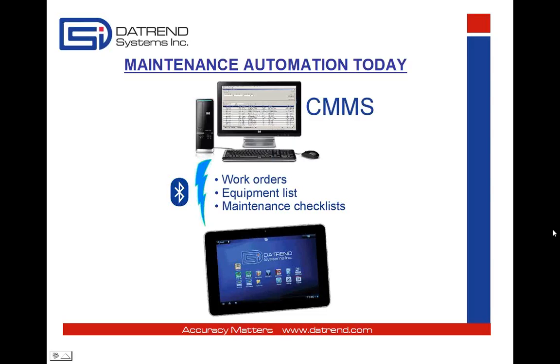Your CMMS is running on a workstation. In the CMMS, you've got your equipment and your schedule, as usual. And also, you've got your checklist procedures, which are linked to particular control numbers and maybe work order numbers. As you might do for a med tester, you prepare the information to be exported. But instead of a med tester, you export that same data to a tablet. And as shown here, it can be done using Bluetooth, pushing work orders, equipment, and procedures from your workstation onto the tablet.